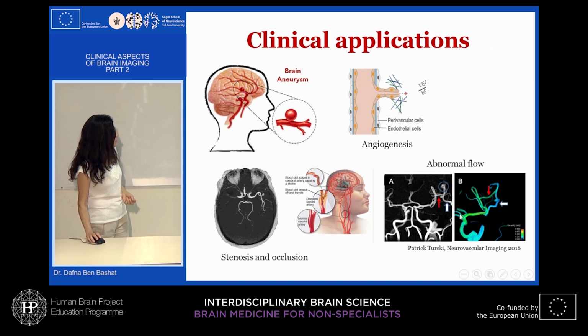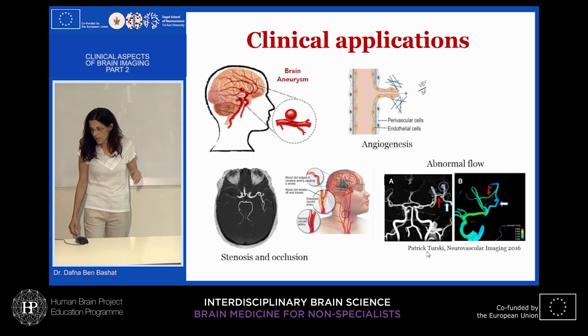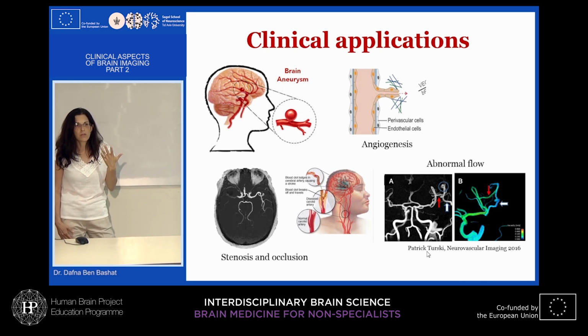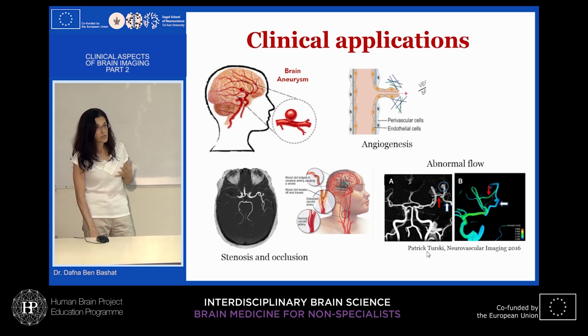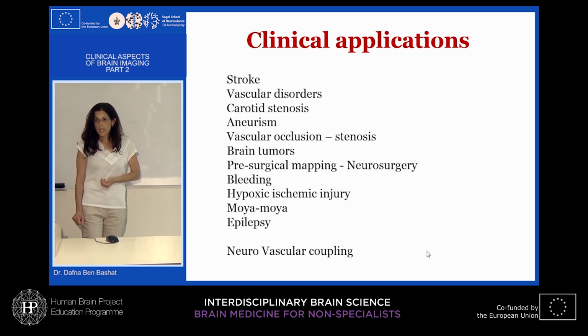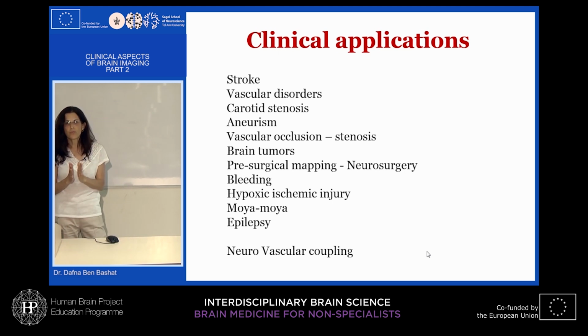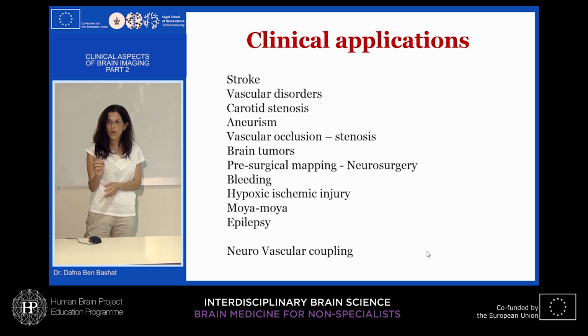And there are a lot of studies also for brain flow, if you want to see any changes in stenosis, cortical stenosis, carotid stenosis, or any stenosis within the brain. So there are a lot of applications, and a lot of these vascular methods are part of a routine protocol. As I said, each patient comes, and once we know the question, he has a specific protocol.